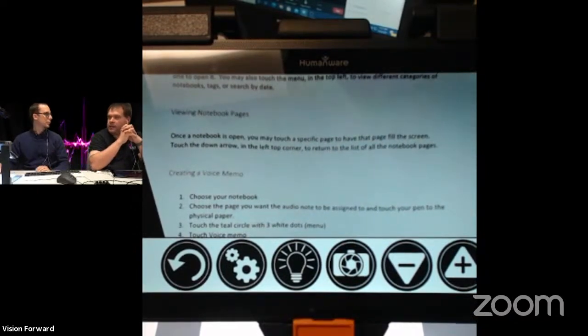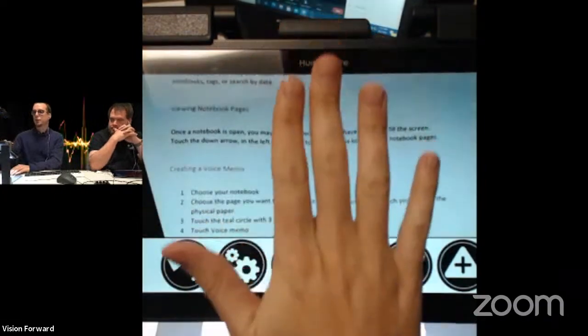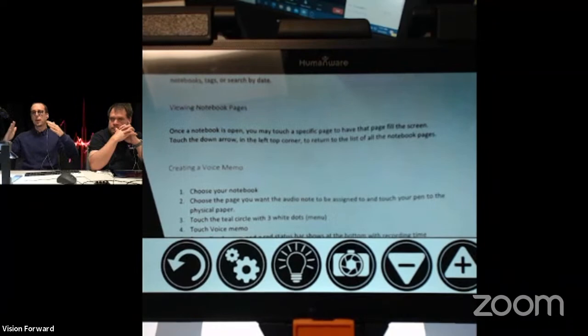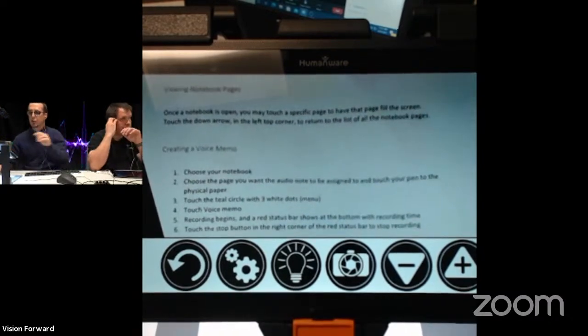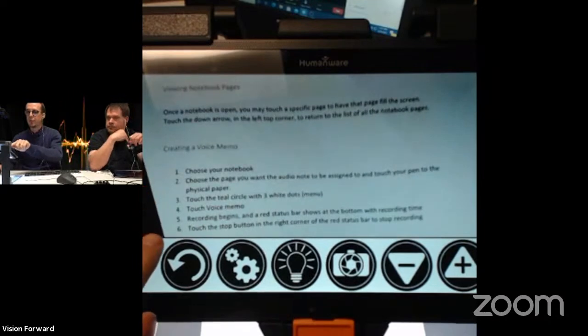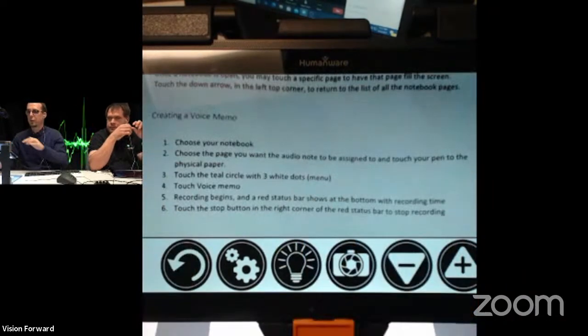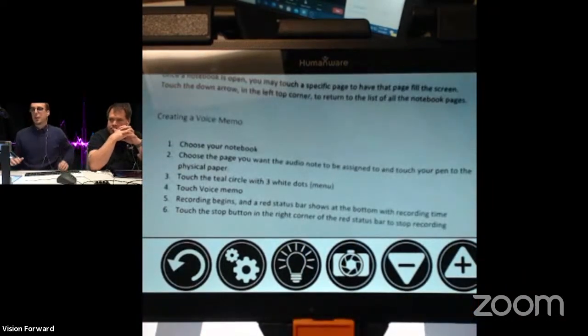Okay, so on the magnifier mode, in some of the early Connect 12s, it had the Star Wars effect. That's been addressed. Because the screen is at an angle with this, and you can adjust the angle of it, you used to get this Star Wars effect where the text was wider at the bottom and thinner at the top, and that would be more apparent the more angled the screen was. Now they did correct that with software. But it actually means that at lesser magnifications you get these black bars at the bottom, but the text remains straight, and as you zoom in, those black bars disappear.